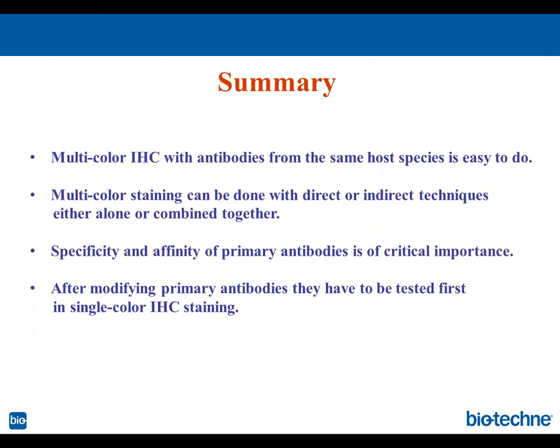One of the reagents is a compound called Sudan black. There was a paper published many years ago on how to use it, I believe in the Journal of Histochemistry and Cytochemistry. Just Google Sudan black and autofluorescence. Sudan black binds to lipids in the tissue, and it quenches the autofluorescence. But when you use Sudan black, make sure that after staining the tissue you don't dip it into alcohols and xylenes, because sometimes when we do permanent mounting using xylene-based mounting media, we have to walk slides through alcohols and xylenes. Alcohols and xylenes will dissolve Sudan black. That's a drawback, so with Sudan black you have to use aqueous mounting media, which is not a big deal. So that's a solution.